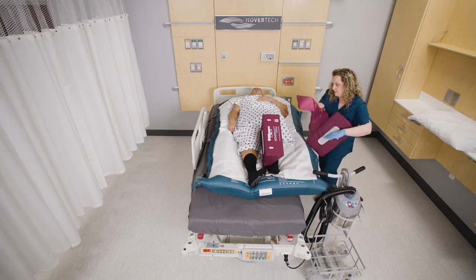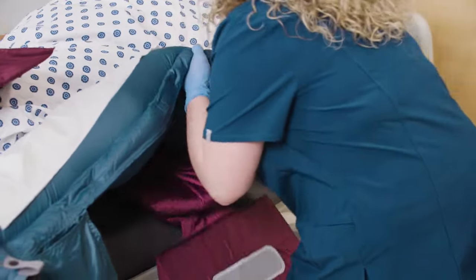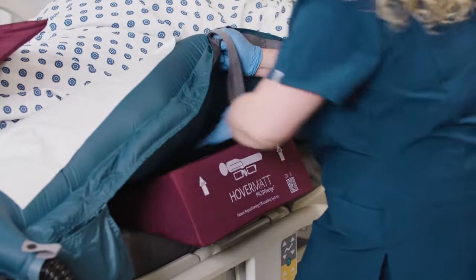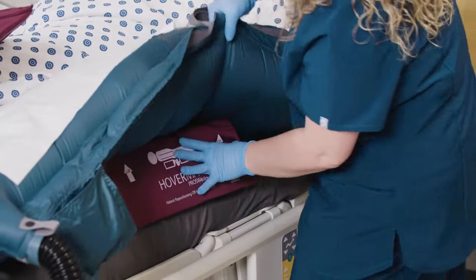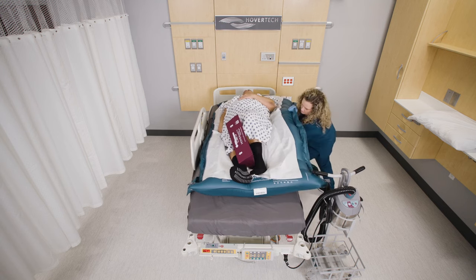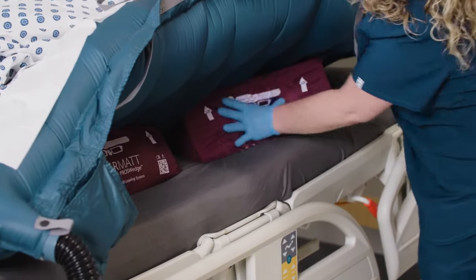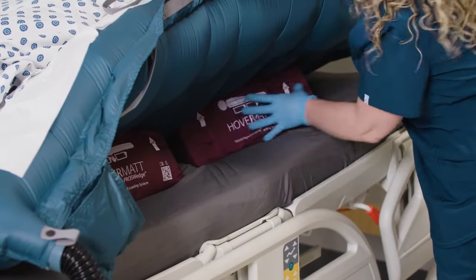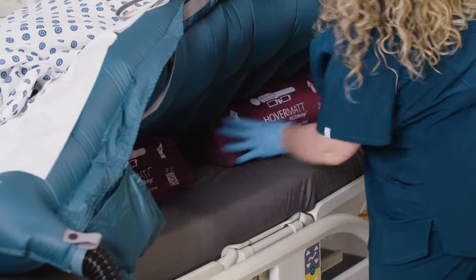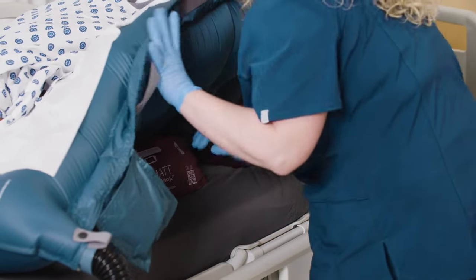Place wedges between the bed and device. Locate the patient's sacrum. Insert the tail of the wedge just under the patient's thighs. Ensure the back part of the wedge is elevated until the position is set, then lower the wedge down to secure in place with the Hold Fast Foam. Place the standard wedge to support the patient's back about one hand's width away from the tailed wedge. Ensure the back part of the wedge is elevated until the position is set, then lower to secure.